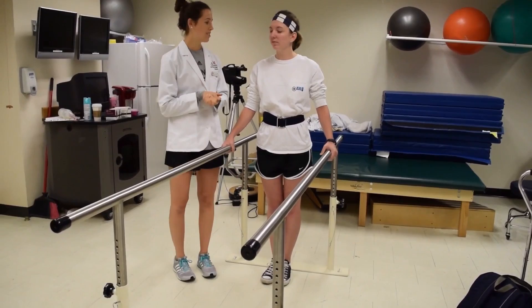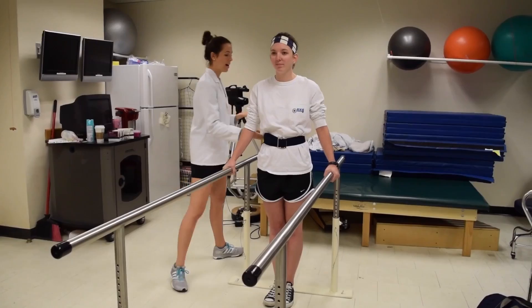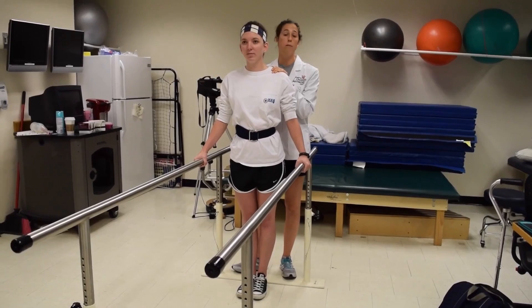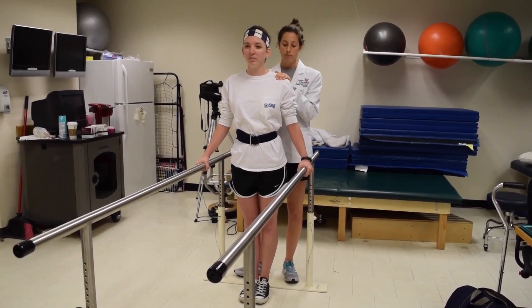Are you ready to get started with the ambulation techniques? As you might have noticed, I have already properly fit a gait belt on our patient. We want to make sure that we are maintaining her safety and stability at all times. As we do these activities, I am going to be grabbing from under the gait belt and then resting my hand gently on her shoulder for guidance and protection.